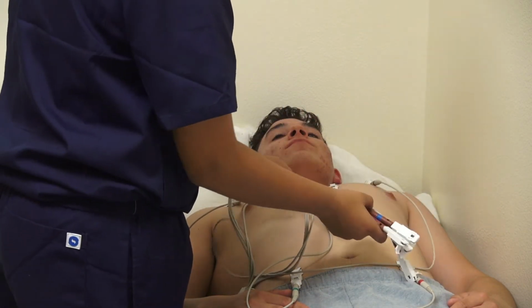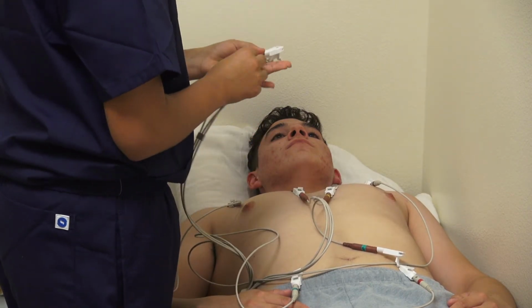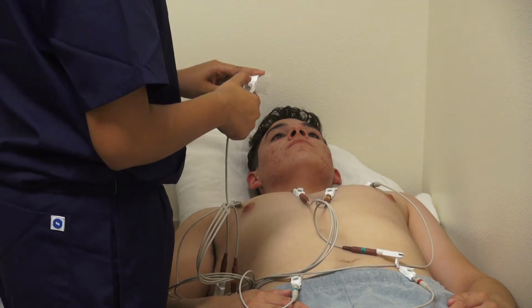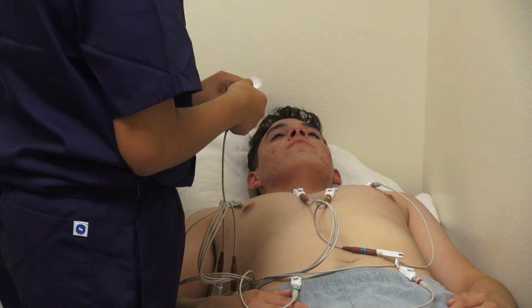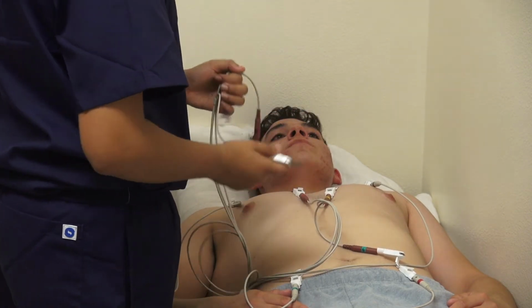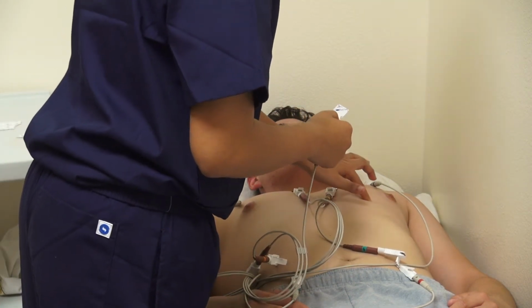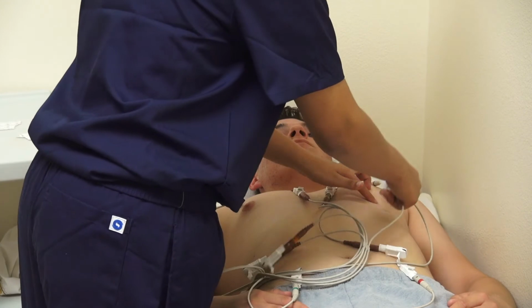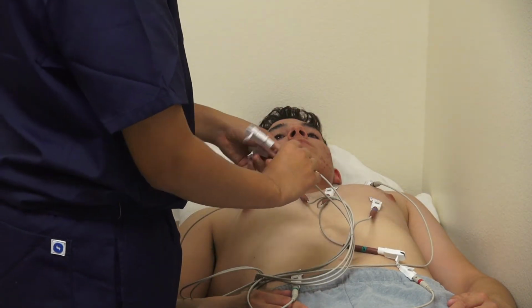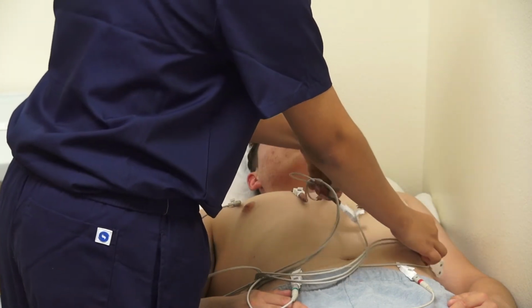The next lead you will place is V4 because V3 will be placed between V2 and V4. V4 will be placed in the mid-clavicular line, fifth intercostal space on the left side of the sternum. Now that you have V4 in place, you can then place V3 in between V2 and V4.